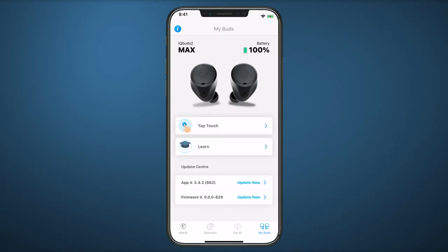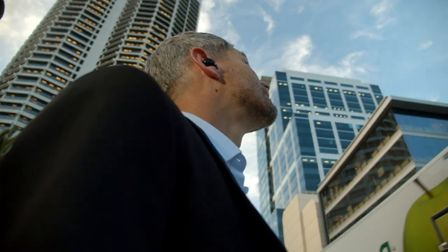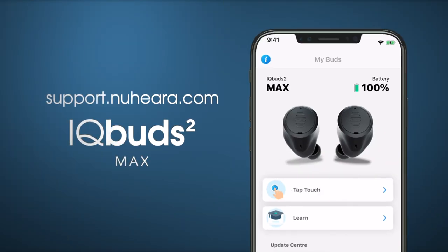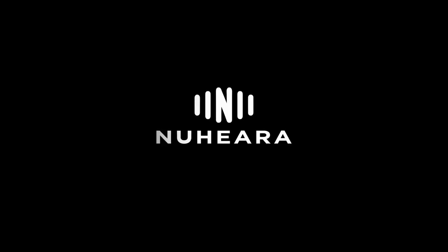You can always check the level of charge on the My Buds screen of your IQ buds app, ensuring you always know when your buds are charged and ready to go. For more helpful tips, please visit support.nuheara.com.